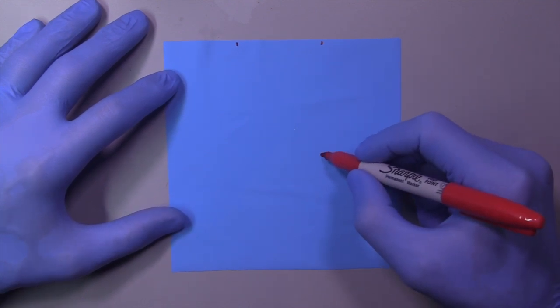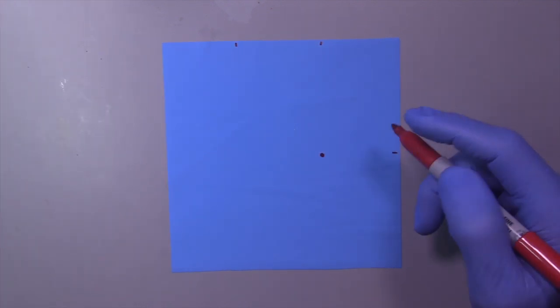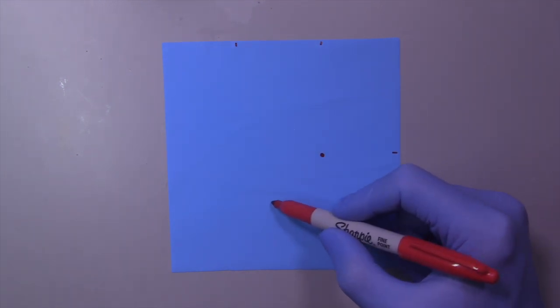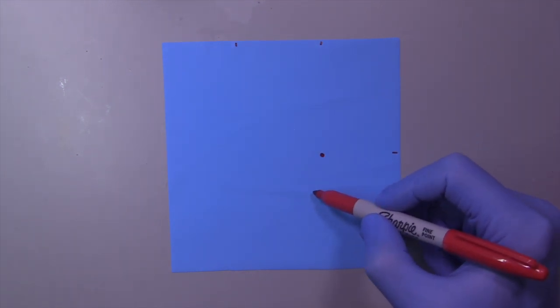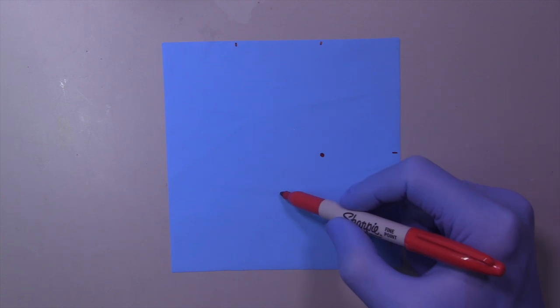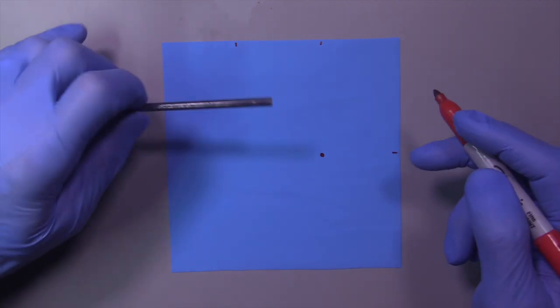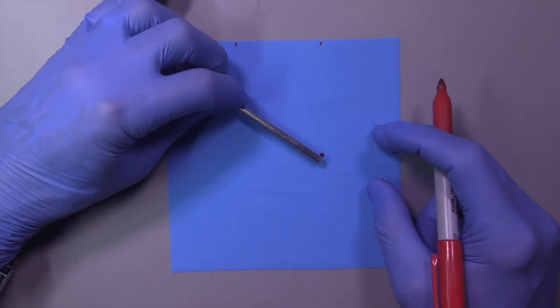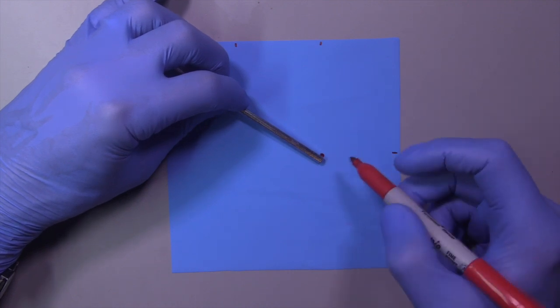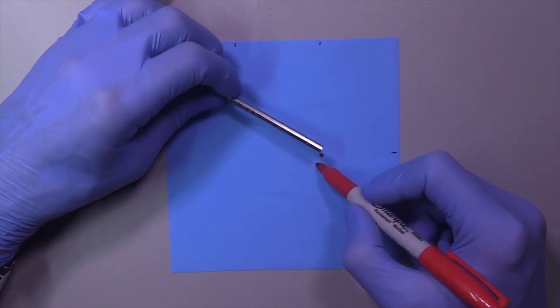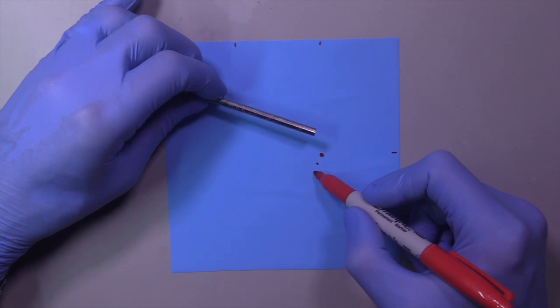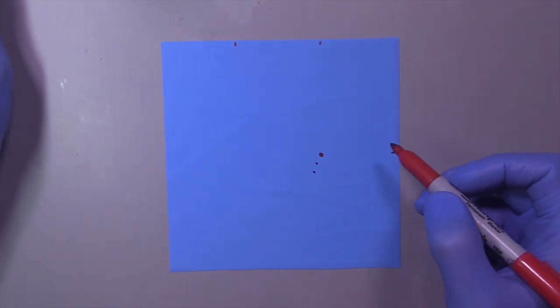And then from the first molar, we're going to go ahead and create the isolation to the midline. And typically I like to run the holes at a slight angle towards the interior with the spacing being approximately a quarter of an inch apart or about the thickness of the handle of a mirror.